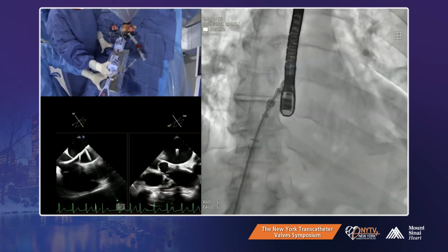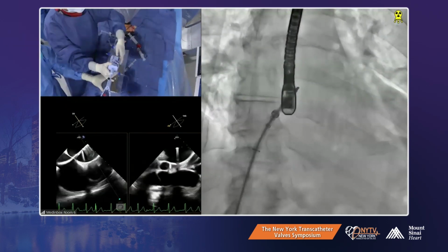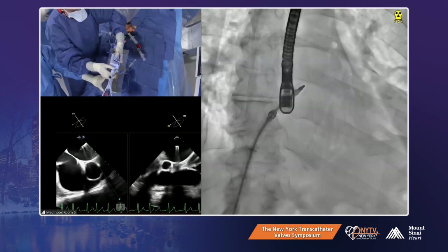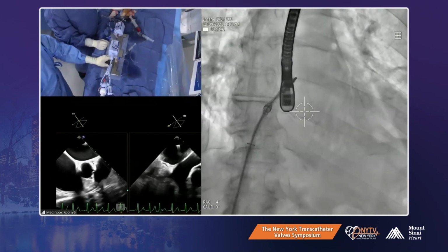You have to get the guide back. We really need better data, detailed slice-by-slice CT data to see if, when, and how you actually pull in the base of the heart by grasping more versus less tissue, because that could be an ancillary benefit. We really need to pull the guide back a little bit.